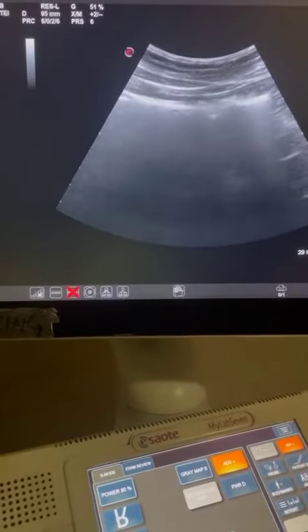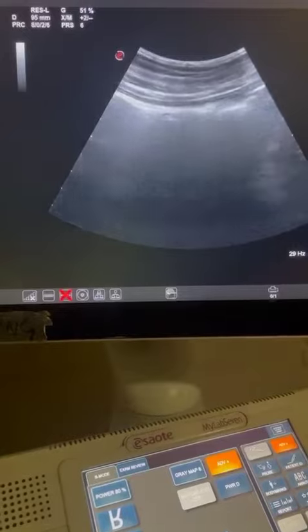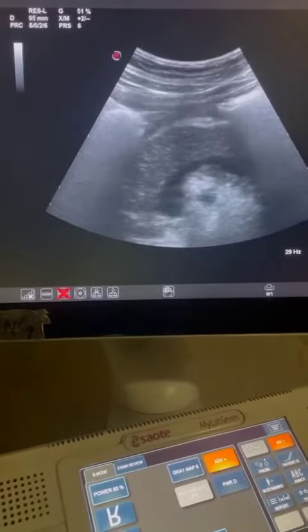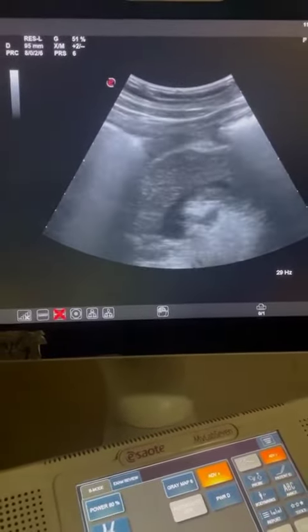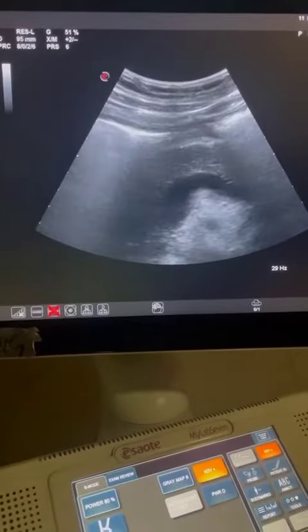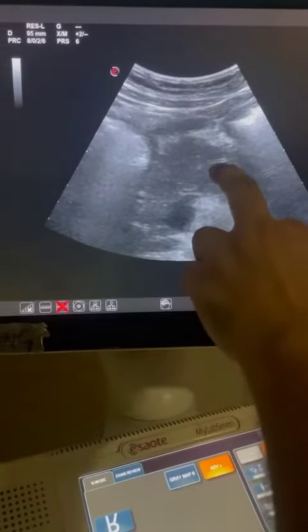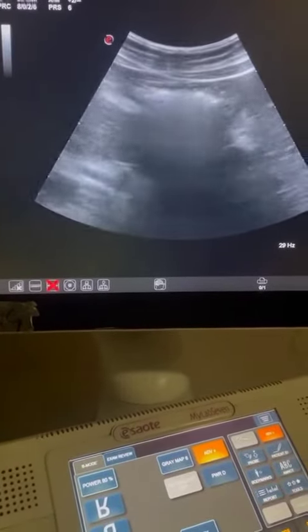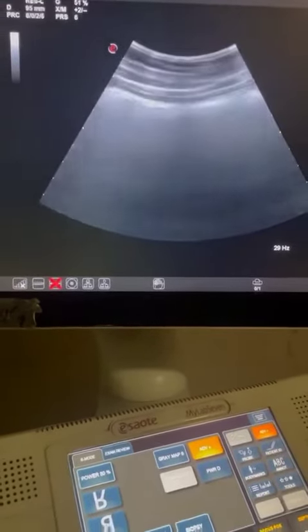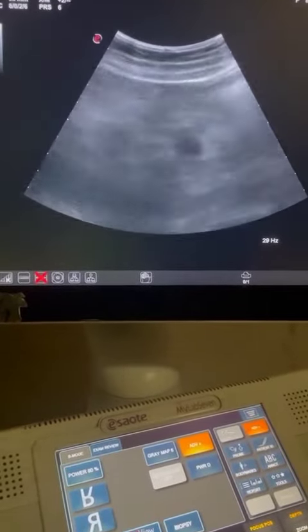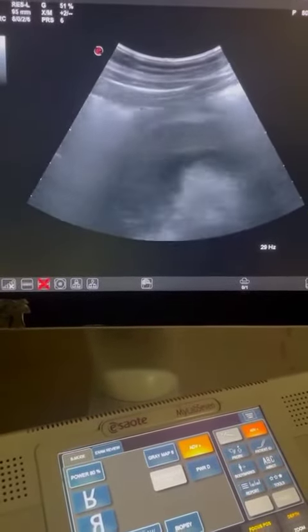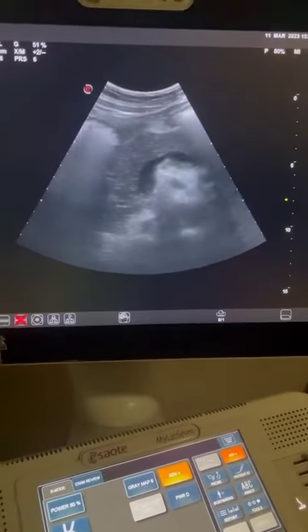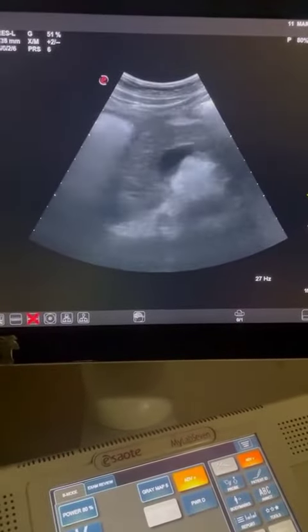Now I am trying to show you the head of the pancreas, which is a bit edematous with a heterogeneous echotexture, and the pancreatic duct is slightly dilated. The finger showed the pancreatic body, which was normal in size and texture, and now I am focusing on the pancreatic head.